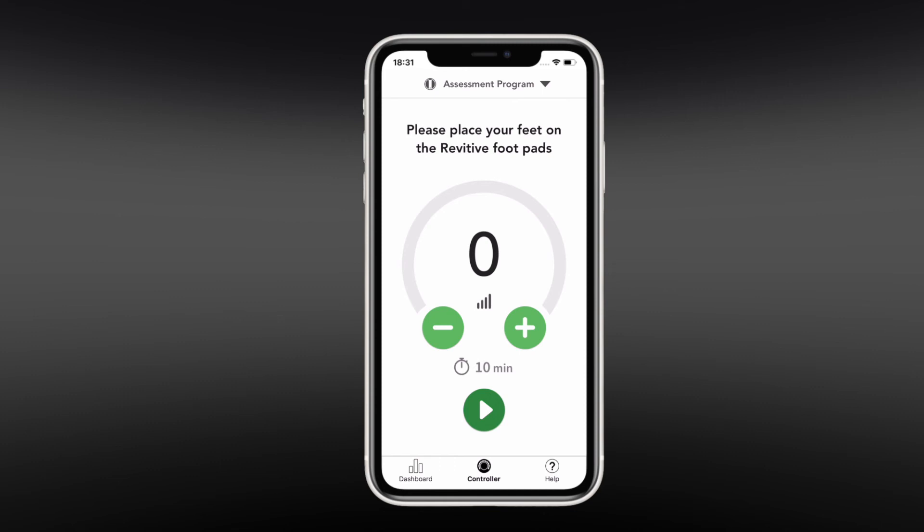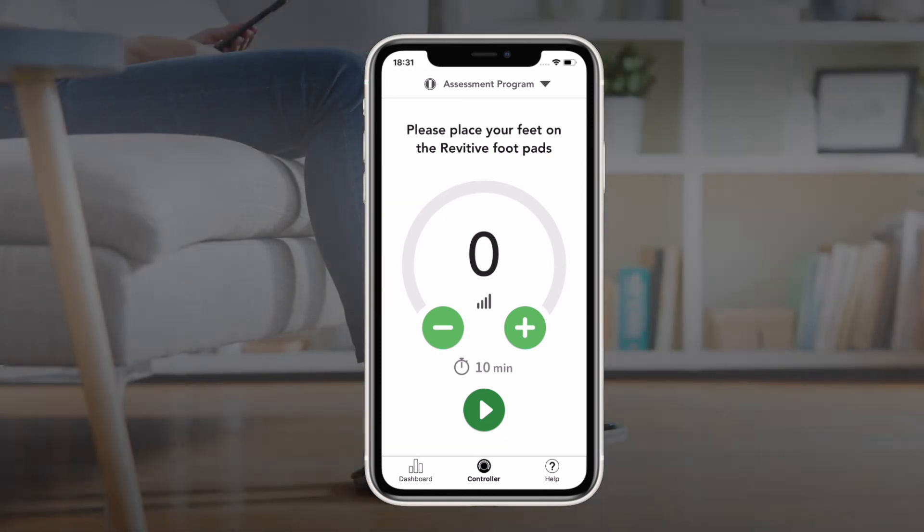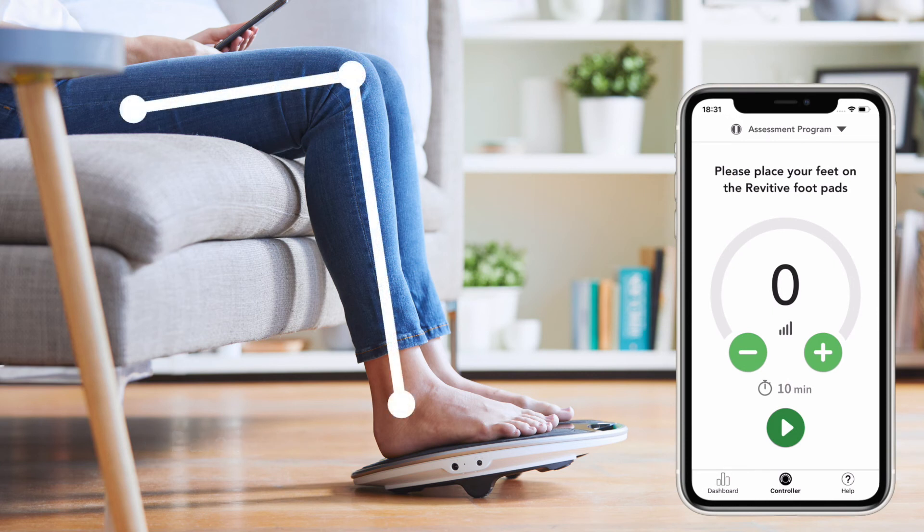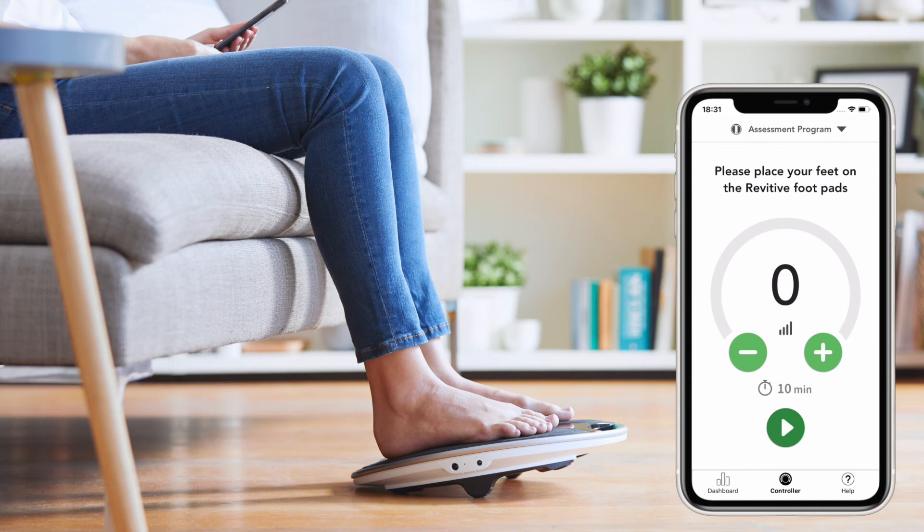The first time you use your device after pairing with the app, it will default to a 10-minute assessment program session. This is intended to help familiarize you with the device and app before officially starting your 10-week therapy plan. Place bare feet on each foot pad and sit so your legs make a right-angle bend at the knee. To start the stimulation, press the play button.